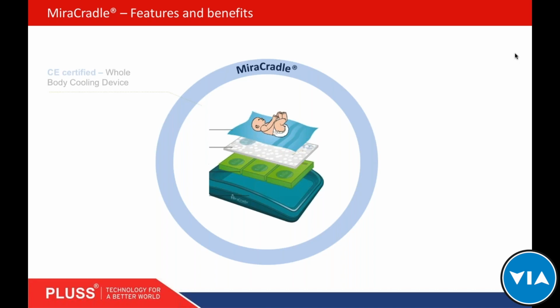This layer, particularly FS21, can be removed subsequently, and the maintenance of temperature is taken care of by the first layer, FS29, alone. The top layer, as you see, is the conduction matrix. It is a gel bed which provides a smooth surface for the baby to lie on and improves heat transfer between the baby and the PCM. And on top of it lies the baby.